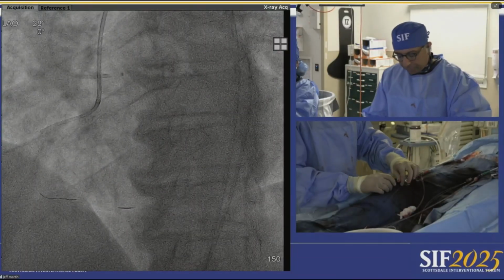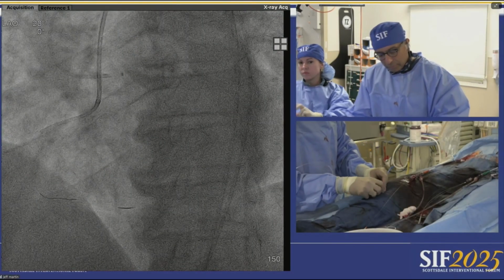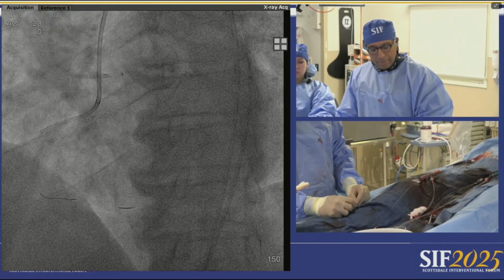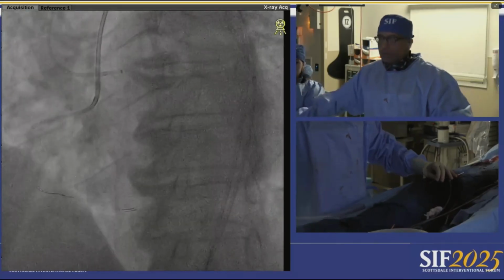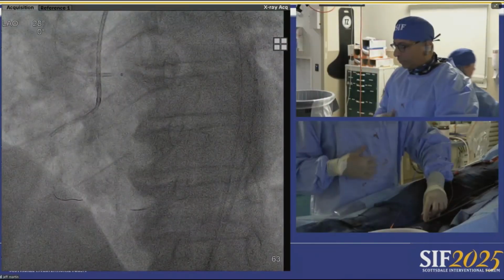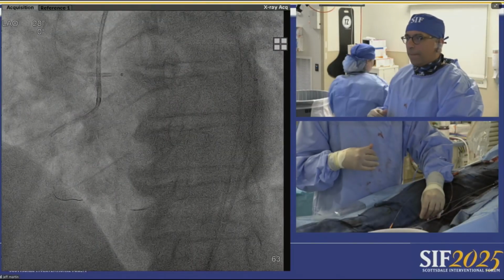Okay. And that bend that you're working on with the Liquid is one of the areas where it's going to struggle, because there's a big piece of calcium, it's rigid, and the angle. So that's just one of the things. Plus, look where the mouth is compared to the rest of the wire. It's going to be potentially a bit unfavorable.